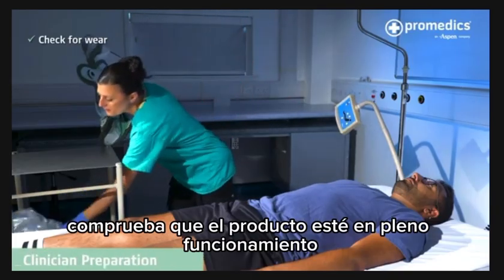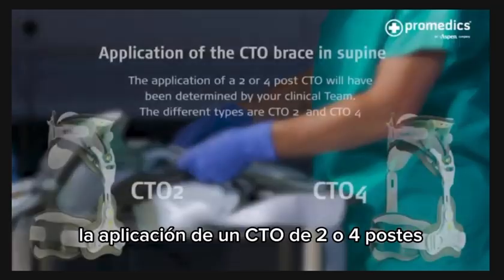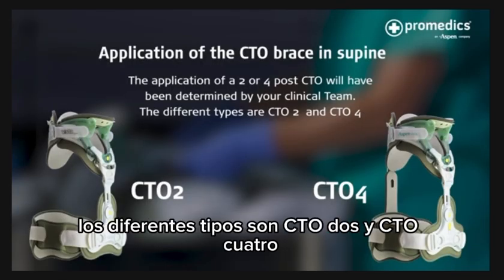Check the product is in full working order by testing all the adjustment points as shown. The application of a 2-post or 4-post CTO will have been determined by your clinical team. The different types are CTO2 and CTO4.